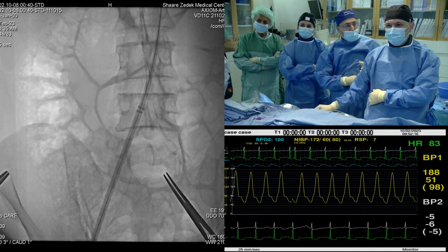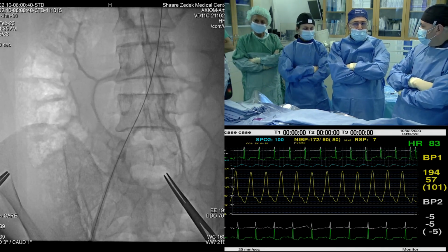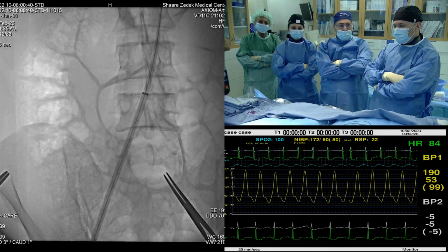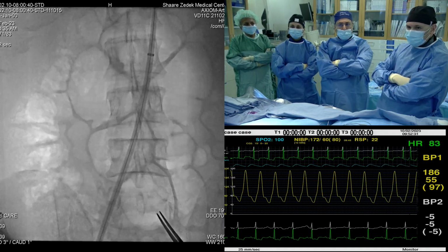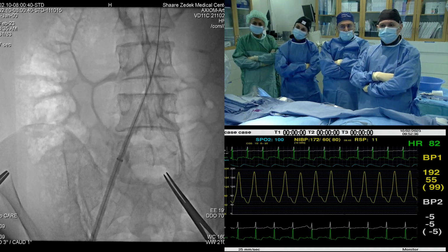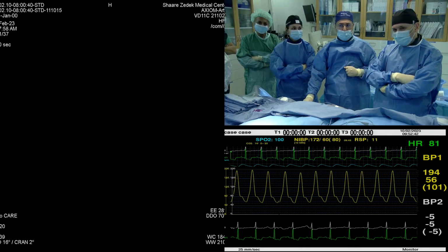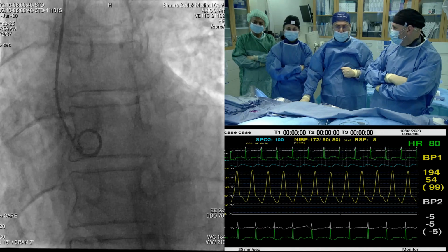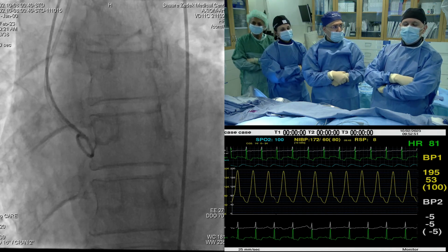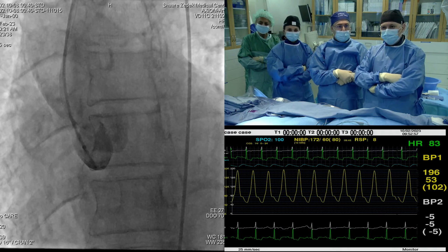So he's a guy with occlusion of the left common iliac, right? And a lot of calcification in the leg, which made us also think that maybe a smaller valve than a 34 would be better here, but that's another argument. Yeah, actually, we have a small mass of the iliac artery. There's some stenosis, and you can appreciate the calcification in the iliac artery. And we know the sizing of the sheath is sometimes different between the 29 and the 34. While we need here 14 French, which is 5 millimeters, the 34 needs 16 French, going up to 5.5 millimeters in the iliac artery.